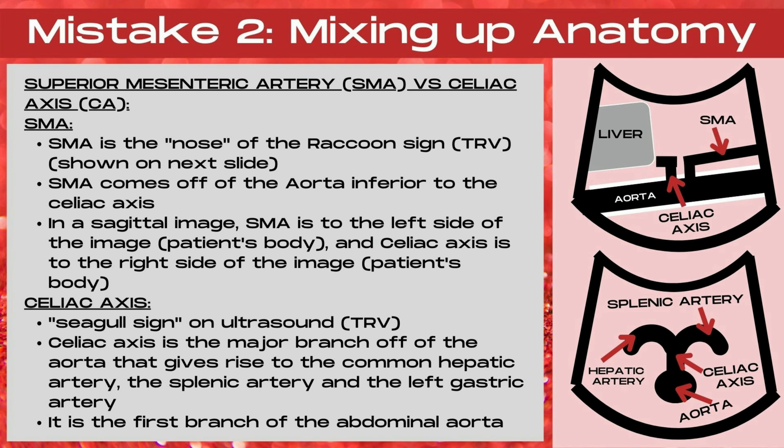In the bottom image is the ultrasound seagull sign. The aorta makes up the head of the seagull. The body of the seagull is the celiac axis, with the splenic artery and the hepatic artery serving as the wings of the seagull, and we can see this in a transverse ultrasound plane.